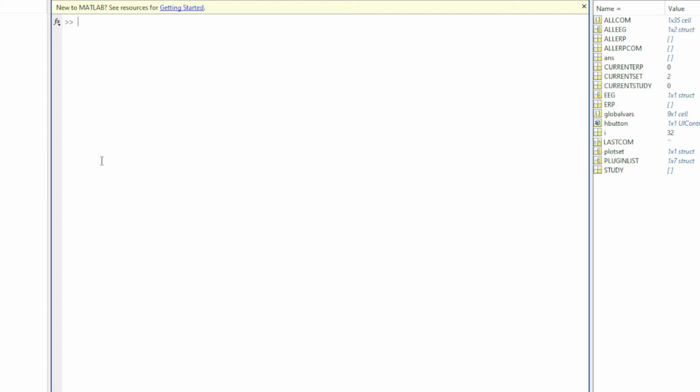So the very first thing you're going to want to do is export the AcqKnowledge file in a way that MATLAB can load. To do that, you would just open the project in AcqKnowledge and then go to File, Save As, and right underneath the file name, there's a drop down where you can change the file type. In the file type, you would just hit the MATLAB option and save it. And then take that file and put it on the computer that you're running EEGLAB on.